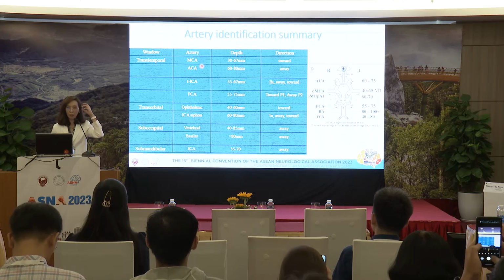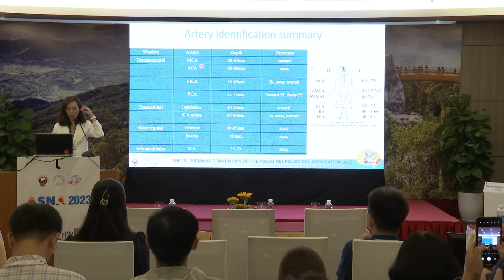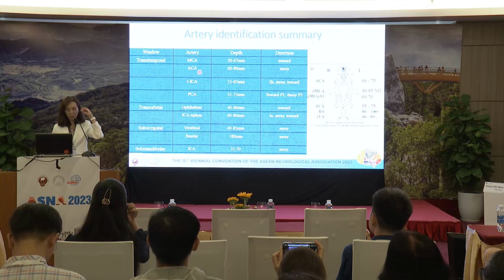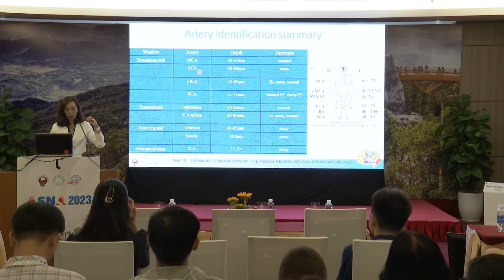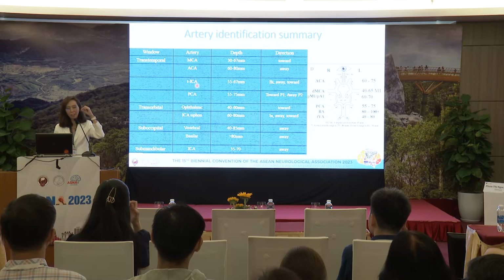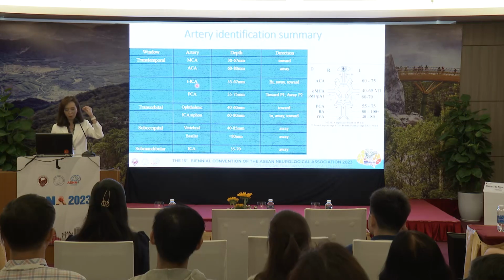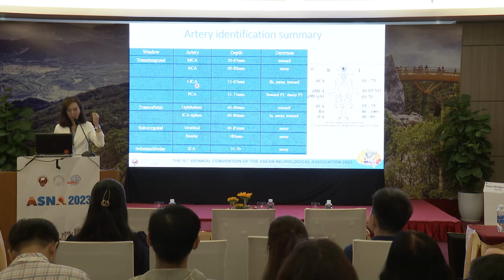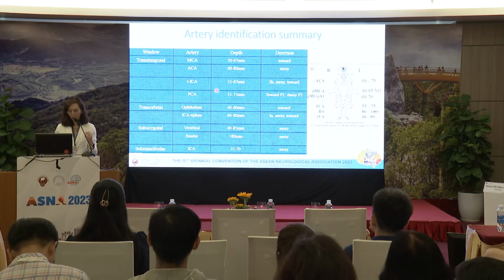And then we move the probe to the anterior part a little bit to find the ACA. But the anterior cerebral artery is going away from the probe. And then we move the probe a little bit downward to find the ICA, and then a little bit backward. This is just minor movement of the probe. We'll try it in the hands-on session. To the back, and we'll find the PCA. So that's for the transtemporal.